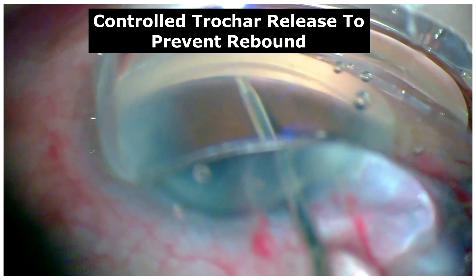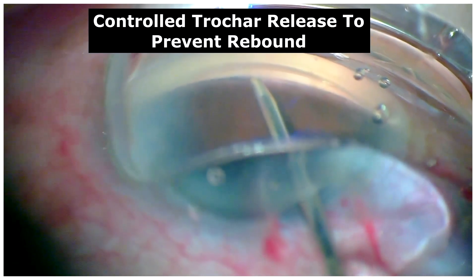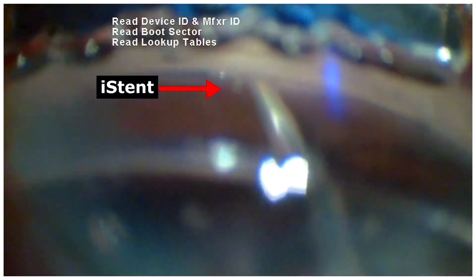Once inserted, the claws need to be opened completely before retrieving the trocar. Following which, the iStent can be gently tapped to ensure its stable positioning.